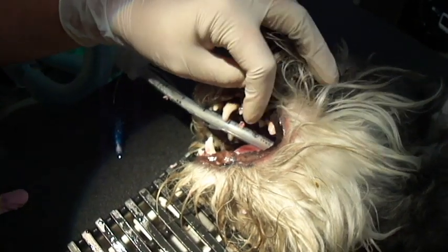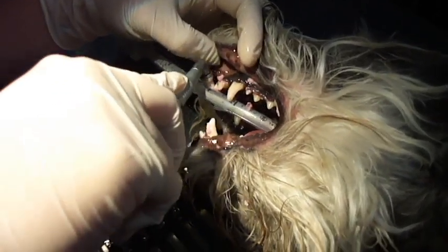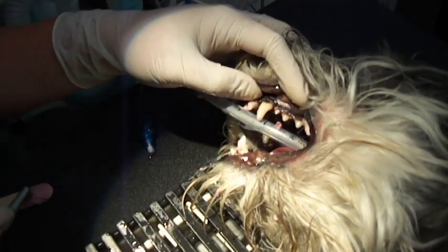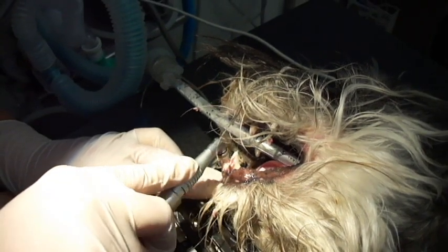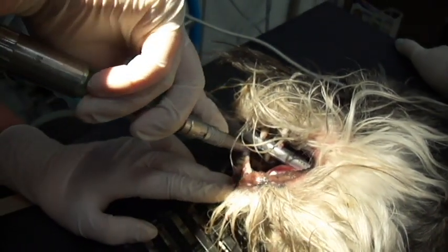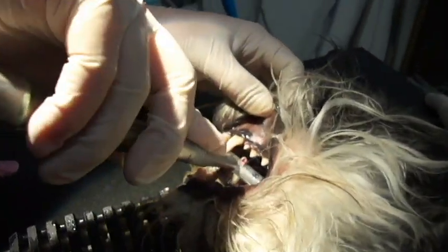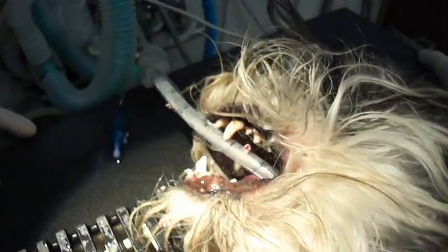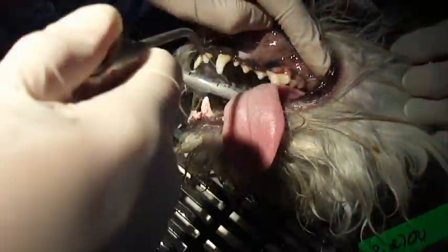You can't smell this polish, but it's bubblegum flavored — scented. I haven't tasted it to see what the flavor is. Bianca's gonna taste it later. Now I'm going to rinse out the mouth again.